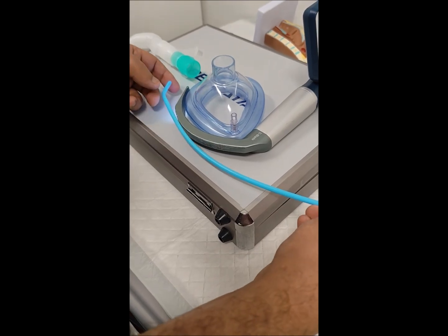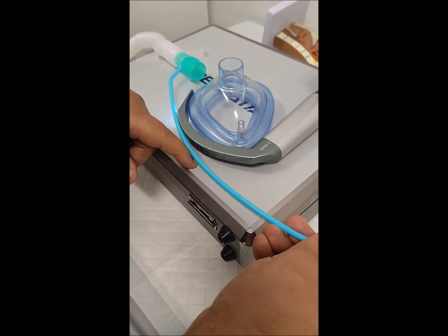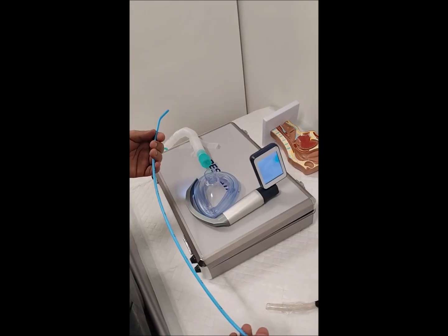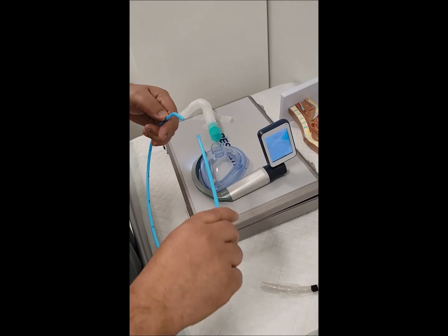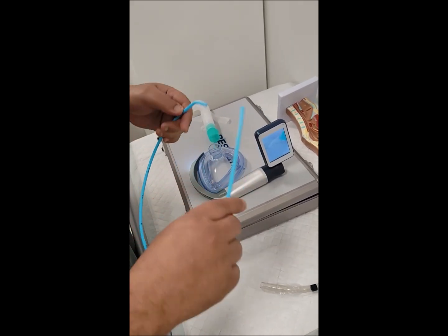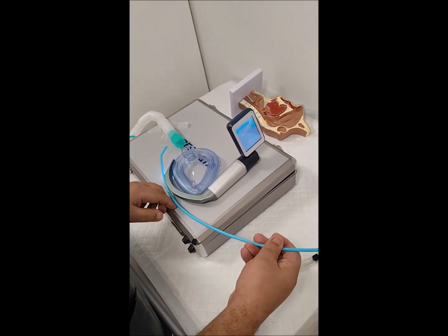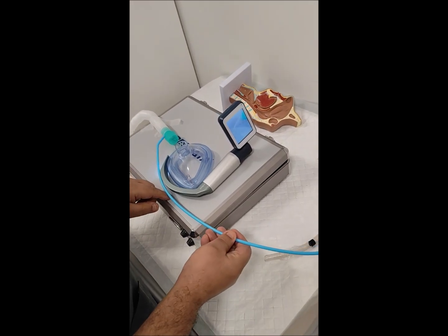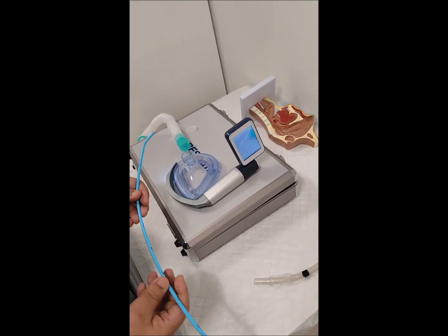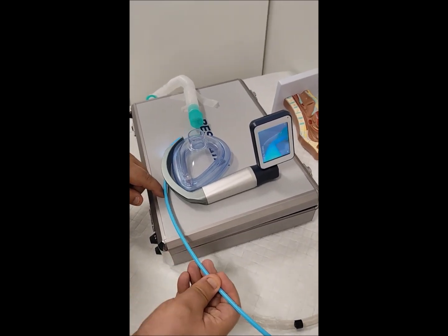The problem with the Bougie is that its angle is fixed and you cannot change it. So if the angle is not enough, you will not go inside the trachea. You can increase the angle by curving it, but this is not usually stable while inserting inside the body. Although the Bougie success rate is better than the stylet, you still cannot guarantee success in all cases of difficult intubation.